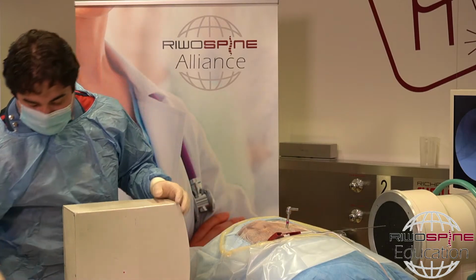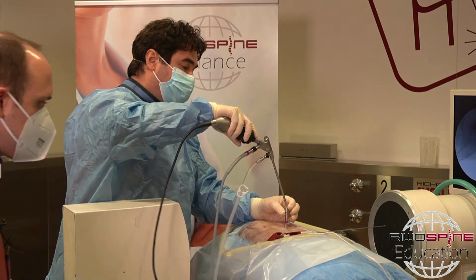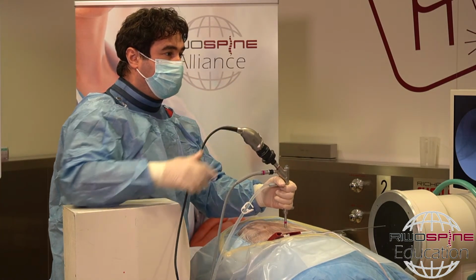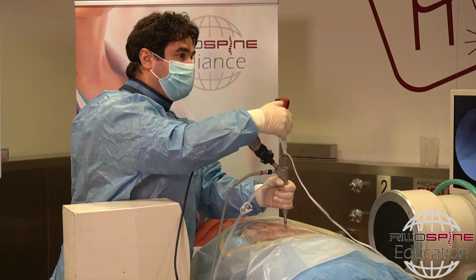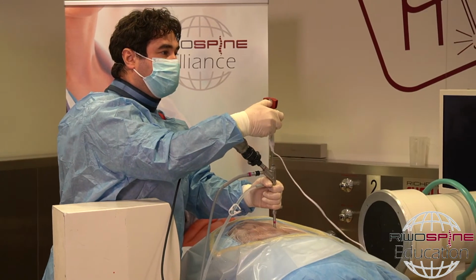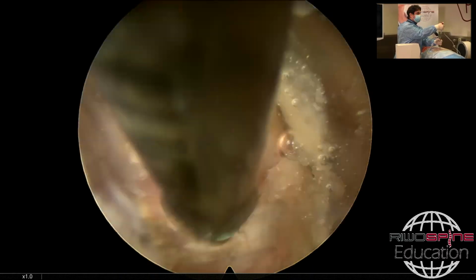The next step is the endoscope. First of all, we have to clean all the soft tissues around the flavum ligament and also the bony structures. What you see here is the soft tissues and the fascia from the muscles.